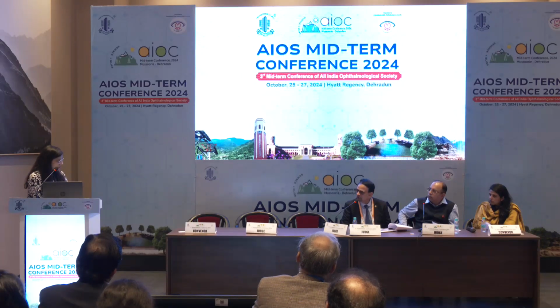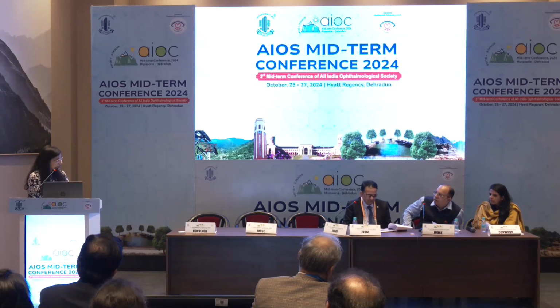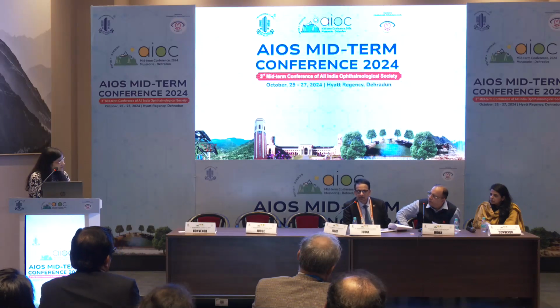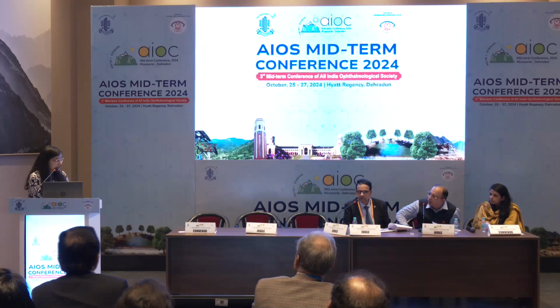Why not an iris claw lens? Sir, that is also one of the possible options. Very simple, no? But usually, did you observe hyphema post-op? No, sir, there was no post-operative hyphema.